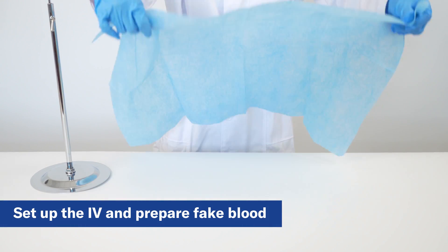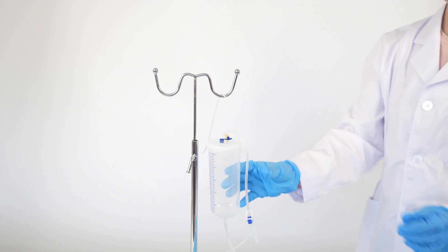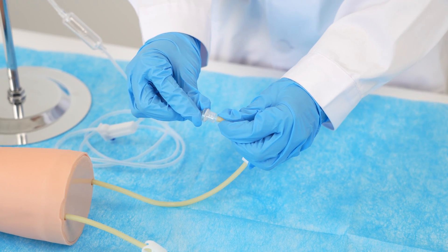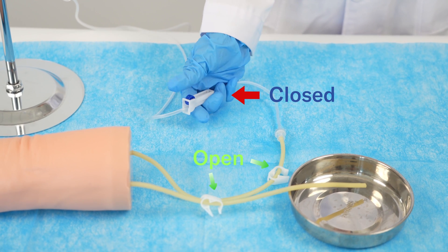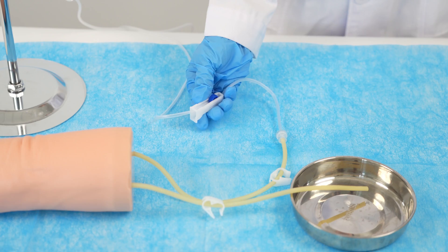Let's set up the IV and prepare the fake blood. Suspend the reservoir container on the crossarm of the stand. Connect the outflow tube of the reservoir container to one of the latex tubes. Place the small plastic container under the other arm tube. Ensure that the roller clamp on the outflow tube is closed and the clip clamps on the arm are open.